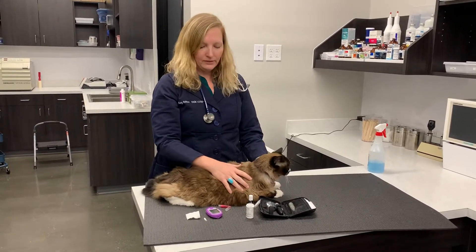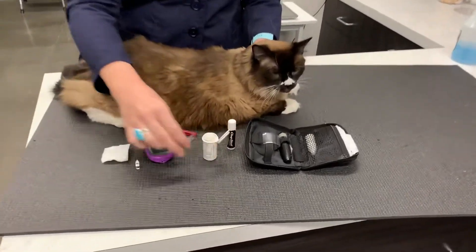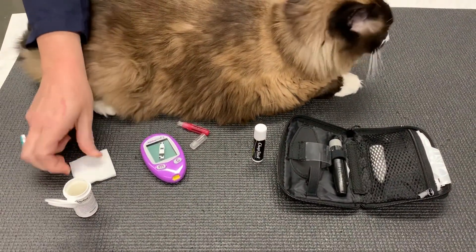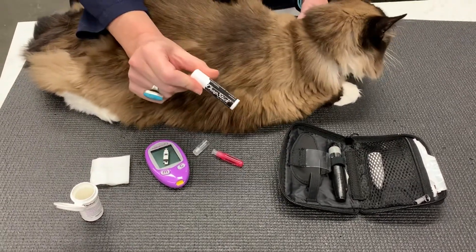We have little Belle here and I'm going to show you the supplies we need. We need our AlphaTrac II, our test strips here which look like this, a little piece of gauze, a 25-gauge needle, and some old-fashioned chapstick.